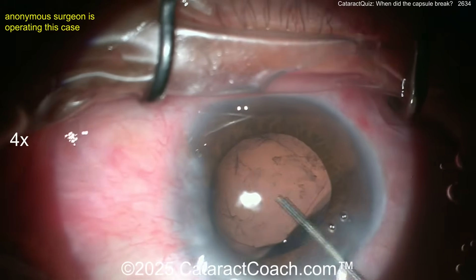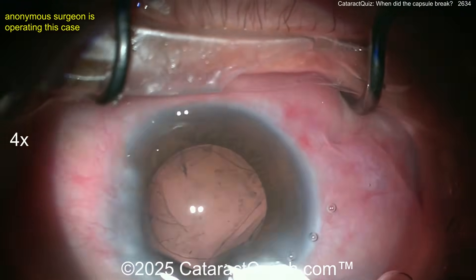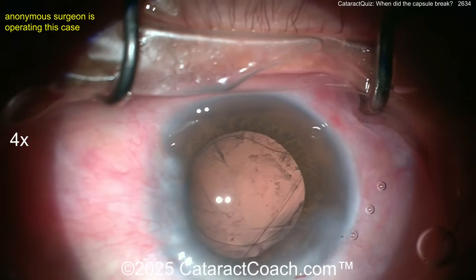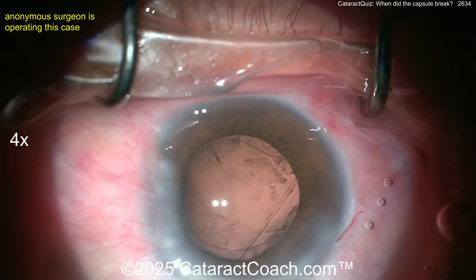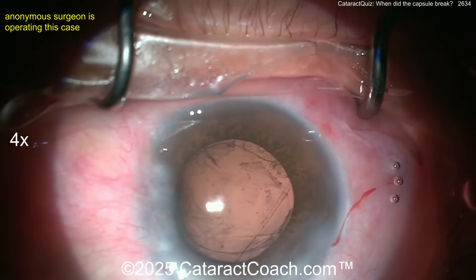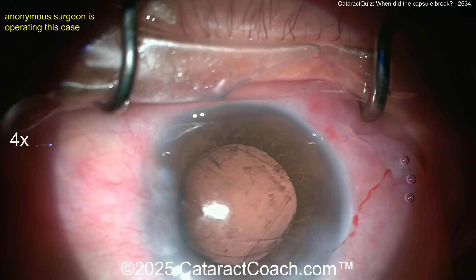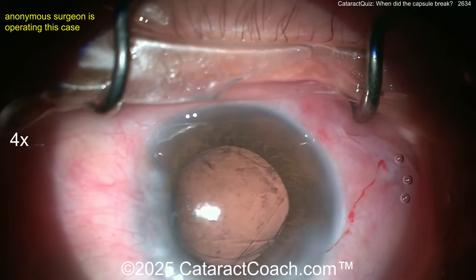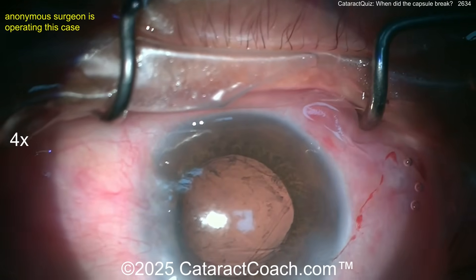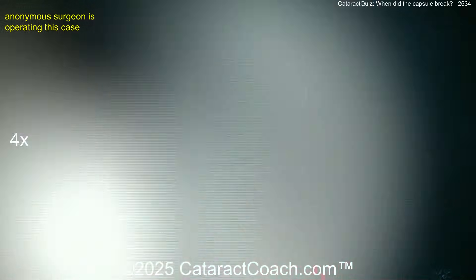What are you going to do? First — is there vitreous prolapse? I don't think so, but it's hard to see because viscoelastic is already in. You can't use triamcinolone to stain vitreous now. Could you just put in a three-piece lens in the sulcus and call it done? That's probably a reasonable option. The break in the capsule is still to the side — it hasn't expanded — so maybe the bag is broken in one part but with no vitreous prolapse.